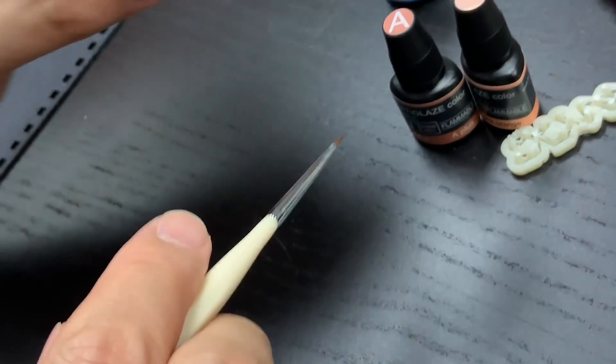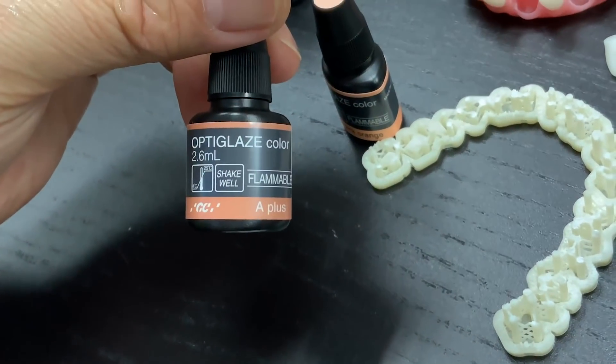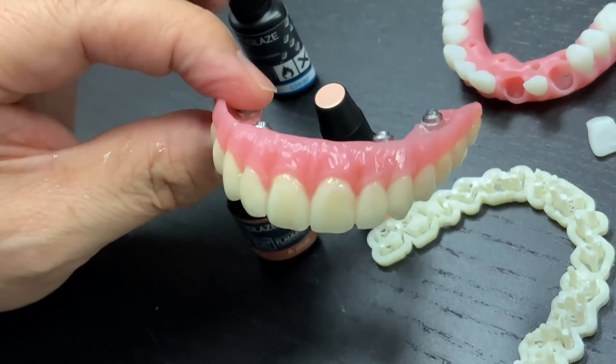I'm using the optic glaze from GC America — you can order it and get a great color result.